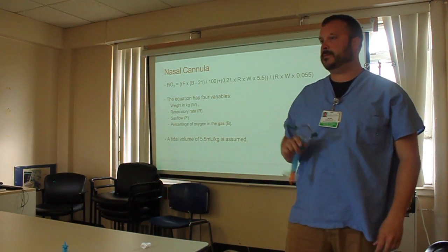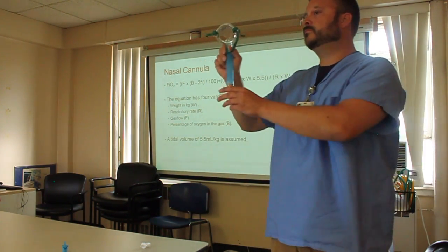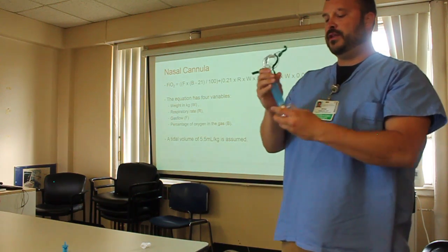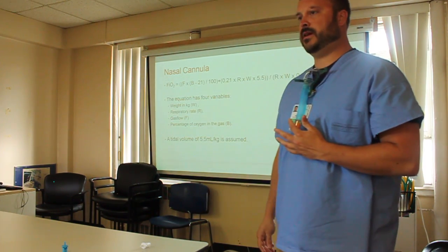Bam. When you connect those two pieces, does it matter which direction the airflow piece is pointing, or you just pop it on and it's good to go? No, that doesn't matter at all. The only thing I would recommend is try not to have it actually facing the patient, where it could just occlude on their shirt, right? Right on. Yeah. Okay.